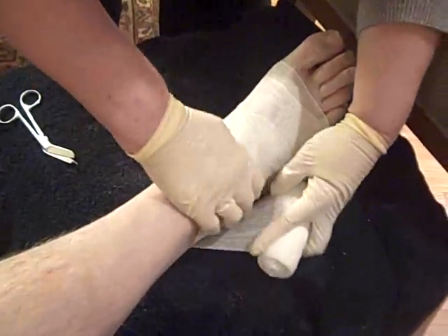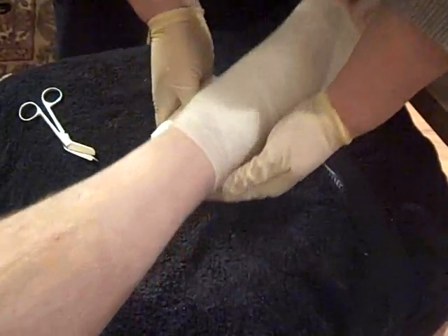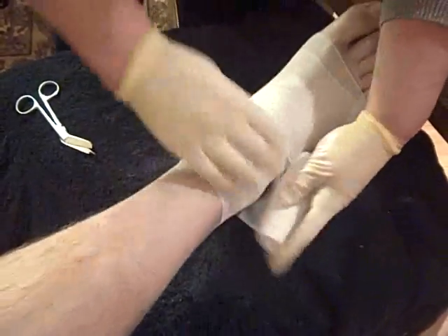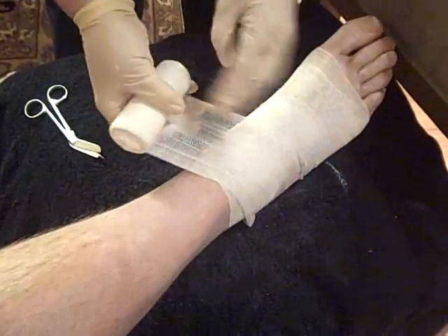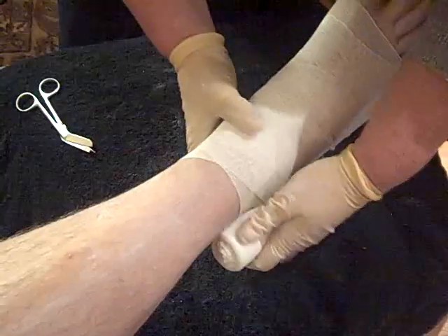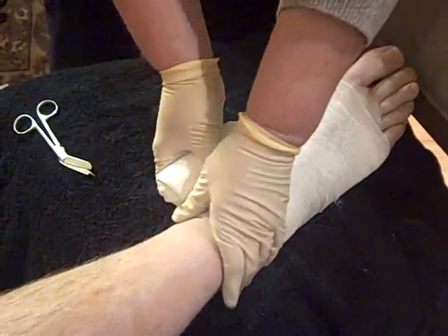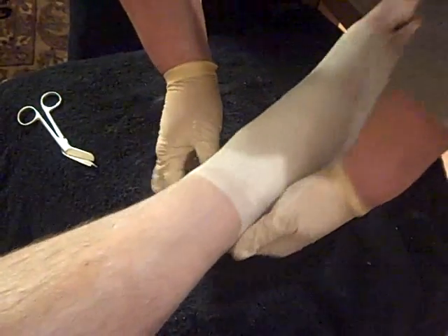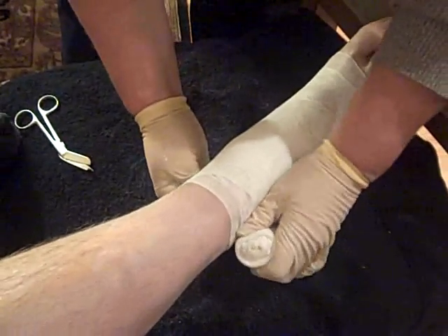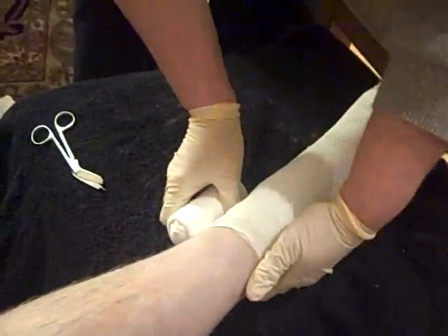When you say move, what does that mean? Does that mean a patient can wear an Unna Boot if they just move from the bed to the chair? No. They have to actually be mobile — they're going to have to ambulate. Because when they ambulate, the rigidity of the boot forces the contraction of the muscle inward, which pushes against the veins, actually forcing the one-way bicuspid valves open and thereby moving the blood up and out of the area.